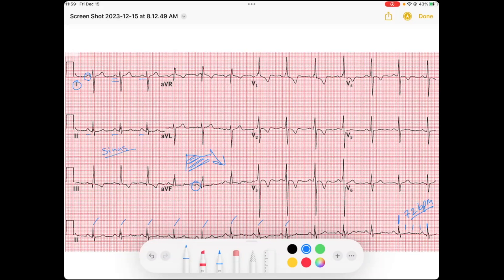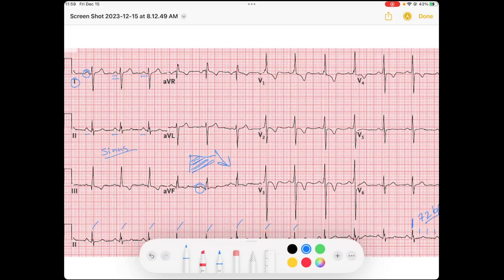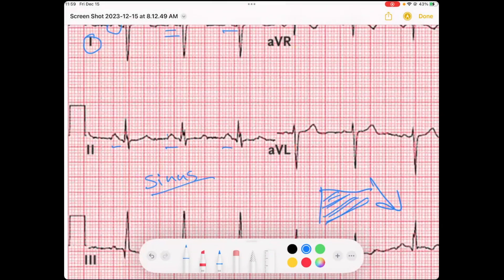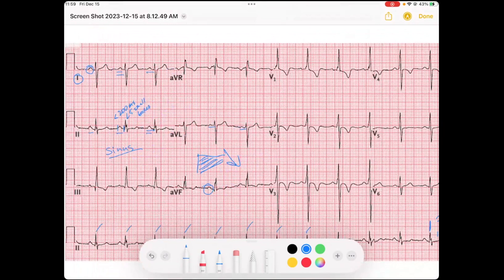The next piece of cardiac conduction to evaluate after our atria depolarizes is our AV node, which corresponds to our PR interval. Looking at lead two, we see our P wave and the start of our QRS, and that looks less than 200 milliseconds, or less than five small boxes. It appears to be the same throughout all the beats, so we can see our AV node is functioning well.